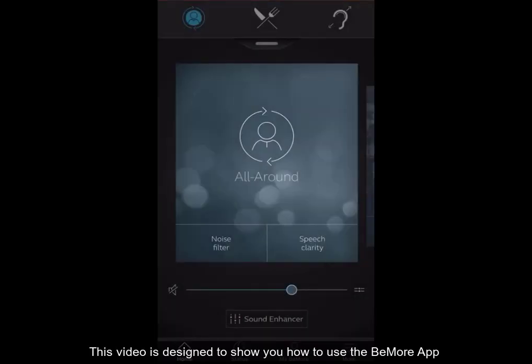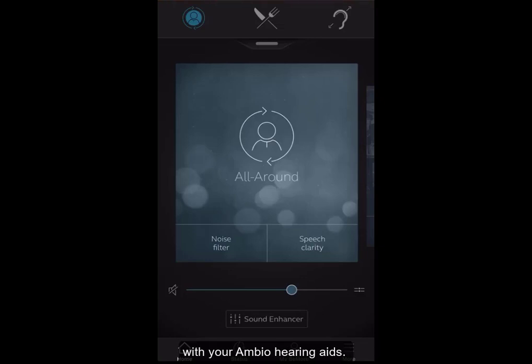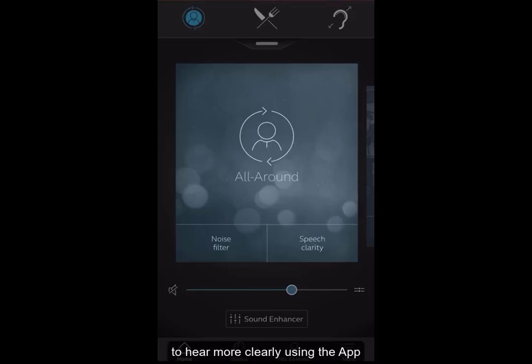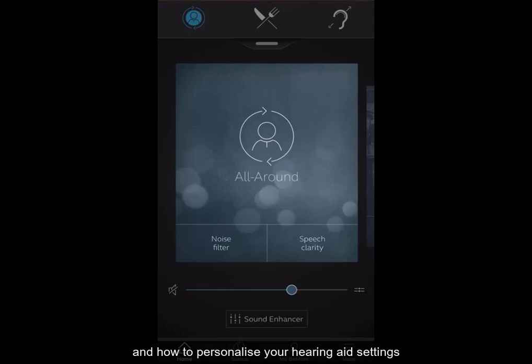This video has been designed to show you how to use the Be More app with your Ambio hearing aids. This video will take you through how to control your hearing aids using the app, how to make changes to try and enable you to hear more clearly using the app, and how to personalise your hearing aid settings.